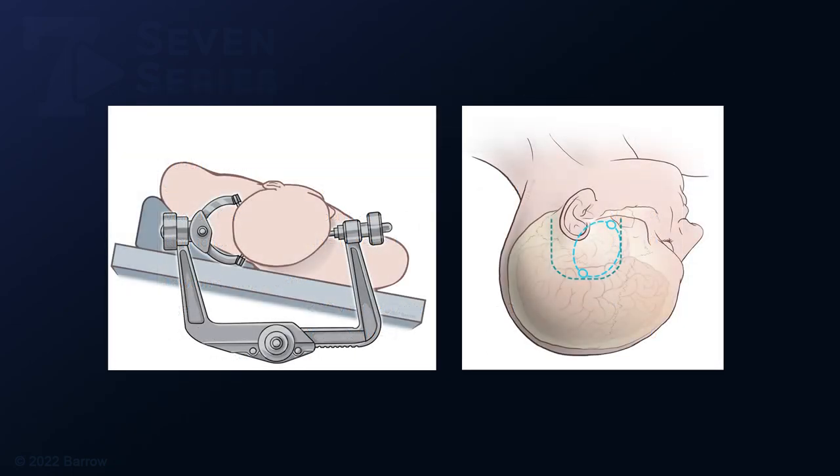A subtemporal approach was selected. The supine position is shown here, as is the U-shaped skin incision over the ear and the subtemporal craniotomy flap.